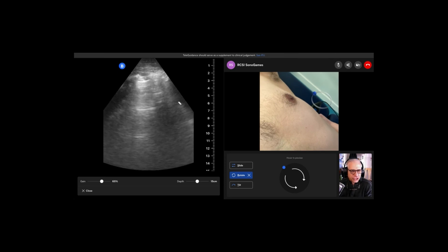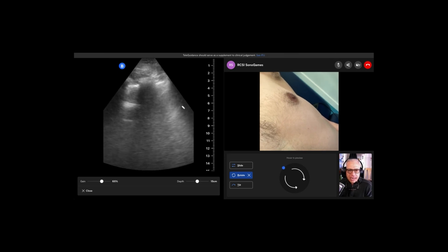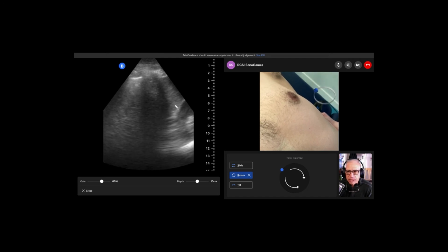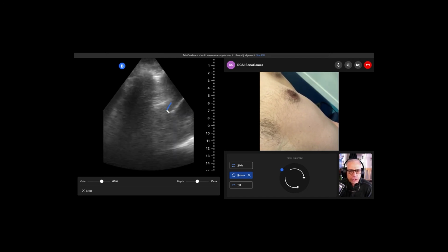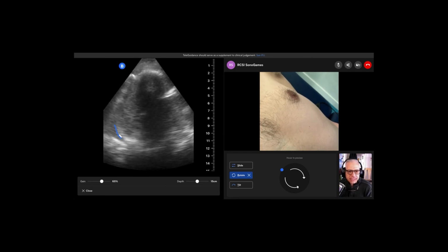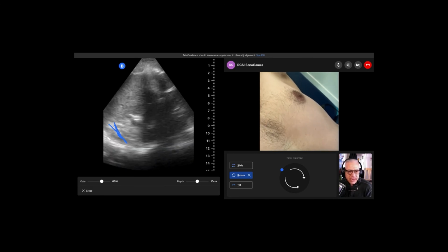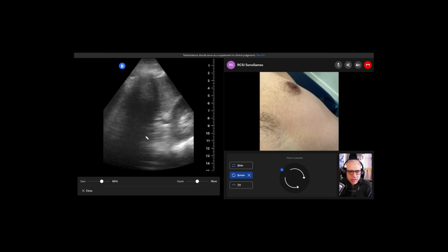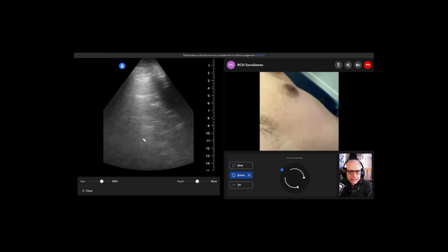And this is a challenging shot. You had it before, so it's there, and it's just a matter of getting used to how to recognize where you need to be. Super. So there's your spleen. Yeah. And so right there, beautiful. See that diaphragm right there? That is gorgeous. Just fantastic. All right.